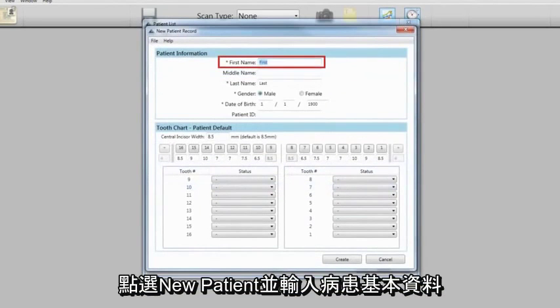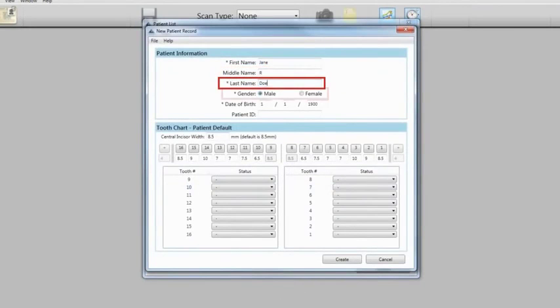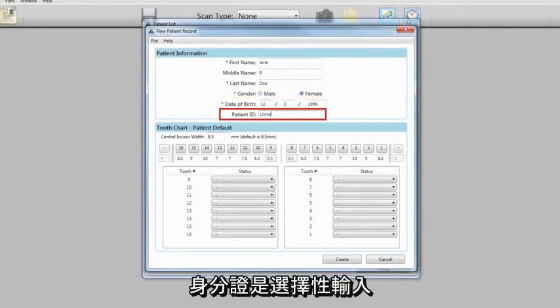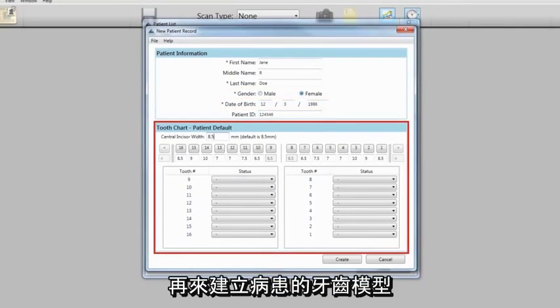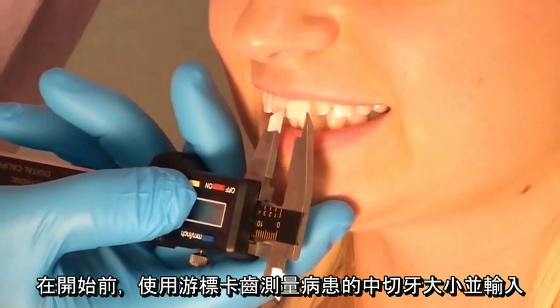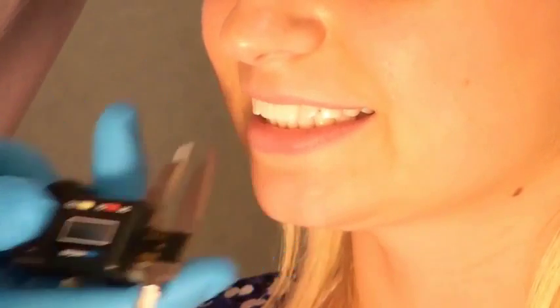Fill in the patient's information: first, middle, and last name, gender, date of birth, and their ID number. The ID number is optional. Next, fill out the tooth chart to create an arch model that replicates your patient's upper dentition. Begin by measuring the central incisor width. Enter this number into the central incisor width field.